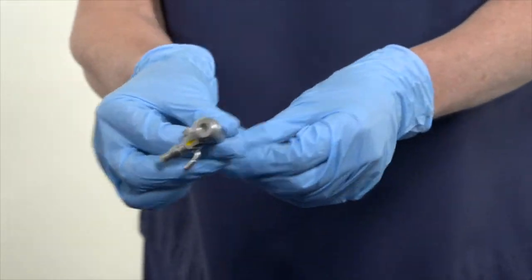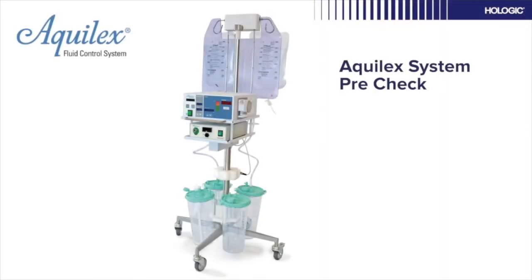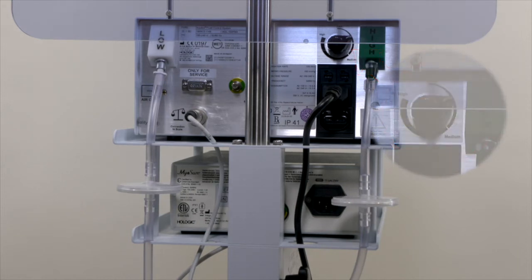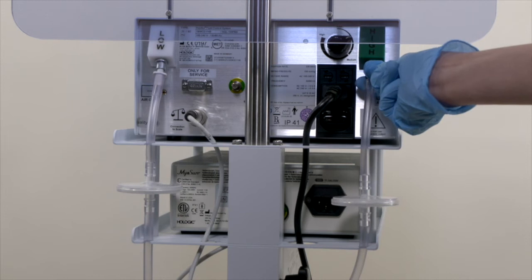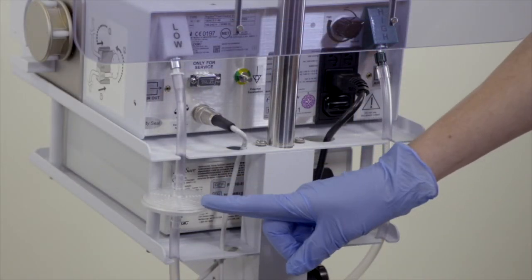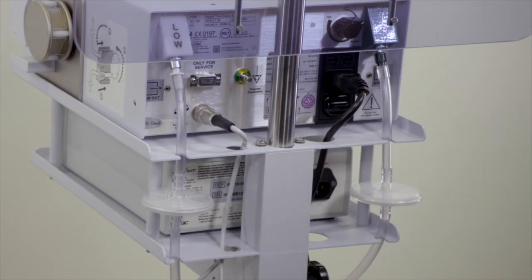Now let's prepare the Aquilex system. We will start with a pre-check. Go to the back of the Aquilex pump and check the black dial is at the 2 o'clock position. Check both low and high reusable vacuum tubes are connected and secure. Finger tighten both. If there is any moisture visible in the vacuum tubing or filter, this will need to be replaced.